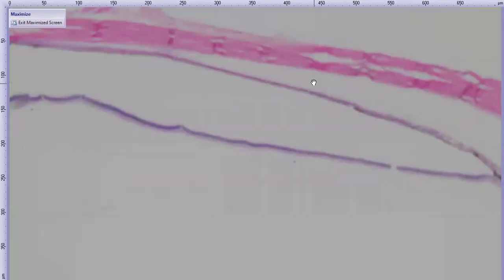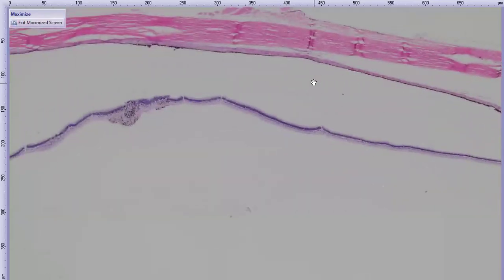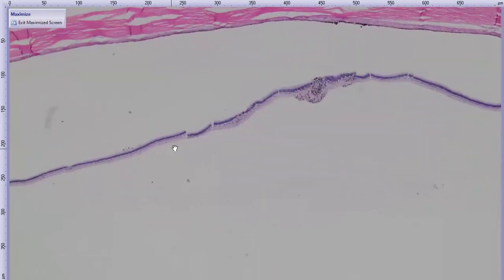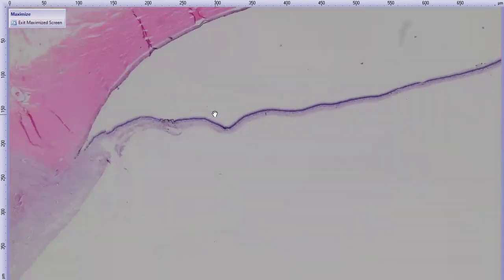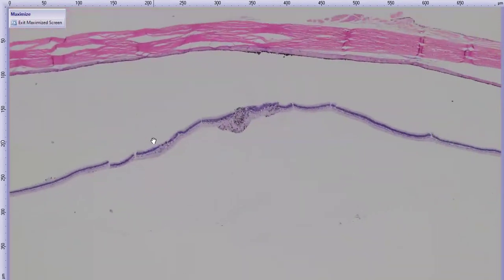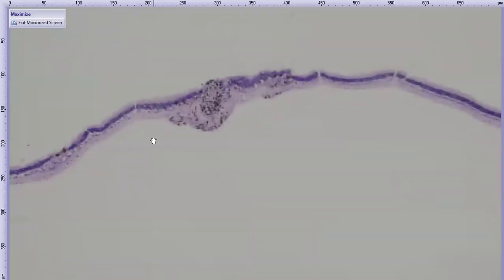And then let's go back to the fundus. And from low magnification, we can see that there are these unusual pigmented spots in the retina. Here's one. Actually, there's another one right next to it that's kind of subtle. And another one here. And these spots are mostly in the ventral retina, although I'll show you another one in the dorsal retina in a hot second. We'll look at the best one here.